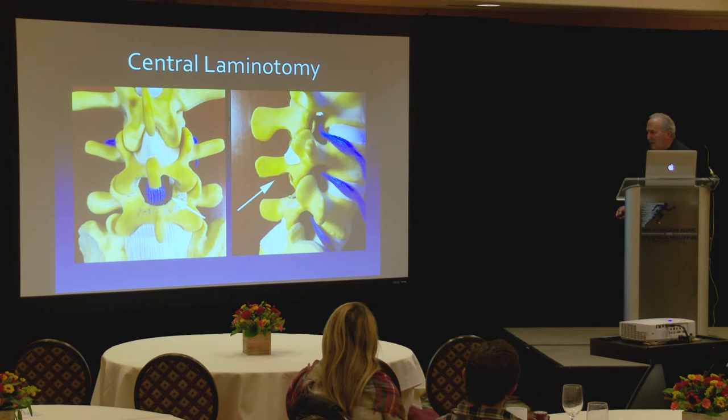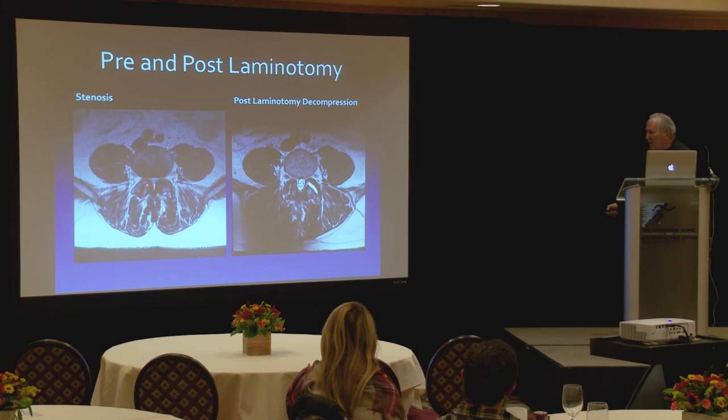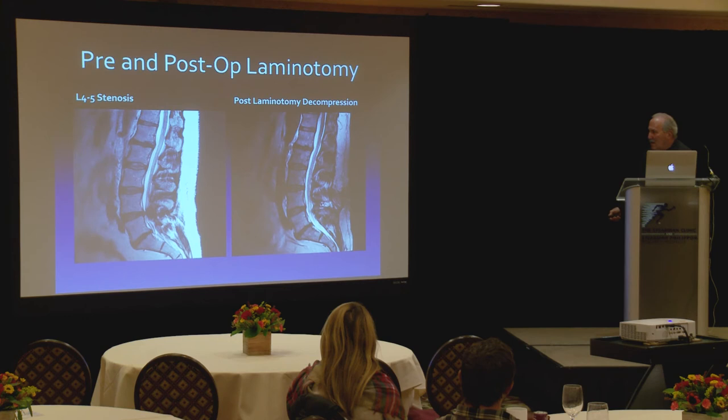So pre-laminotomy here, you can see significant stenosis, post-laminotomy here. But is there something that's on this one that's not on this one? Huh? Facet. So even though we do a simple little decompression, the facet can start to fail. And that is one part and parcel of the problem with these patients. Again, a 4-5 problem here, a simple laminotomy decompression, and they no longer have stenosis.